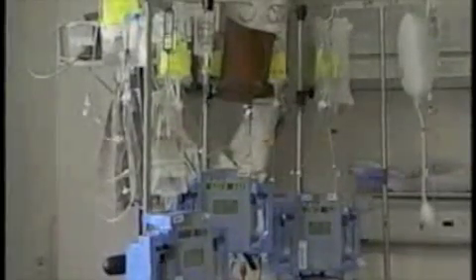Intravenous infusion pumps raise a number of usability issues. Here, this patient after heart surgery is on 10 different infusions through 6 different pumps. Figuring out which drug is being administered through which infusion pump can be difficult. In addition to issues with regard to patient safety, these heavy pumps on the tall IV poles can tip over and injure care providers. When a device's user interface design is flawed, it can promote use error.